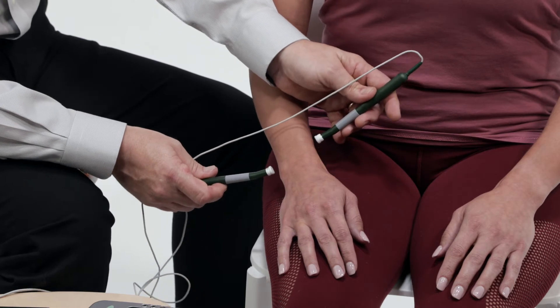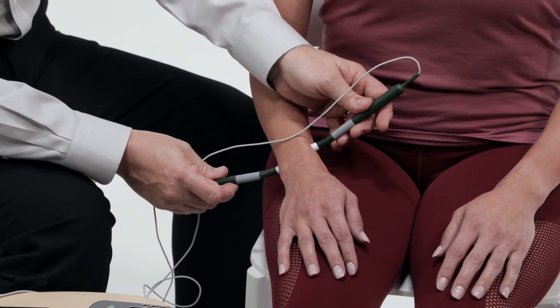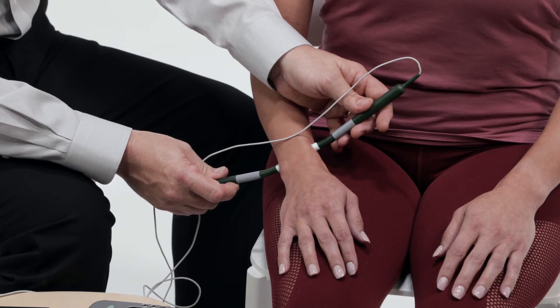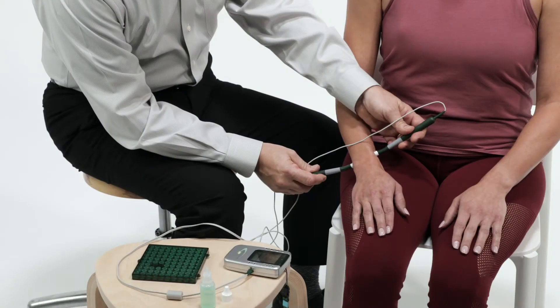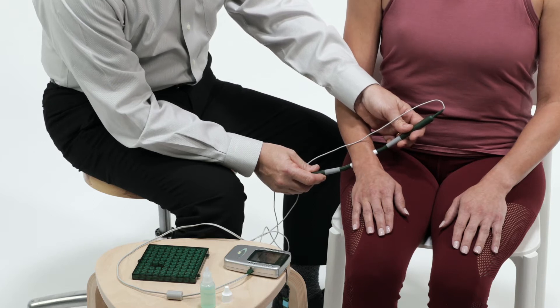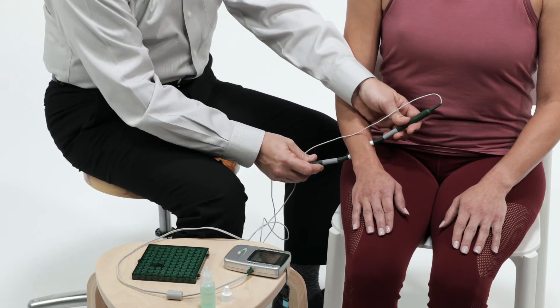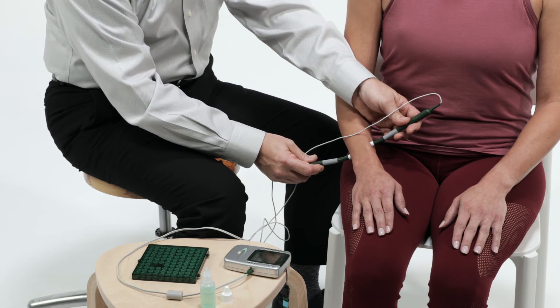When the timer ends, one probe must be lifted up and placed back on the skin to restart the timer. Two smart probes must always be used together to complete the electric circuit going through the area of pain. Imagine the current traveling in a line from one probe tip to the other probe tip. Please be sure to follow each step, as they are all important to successful treatment and pain relief.